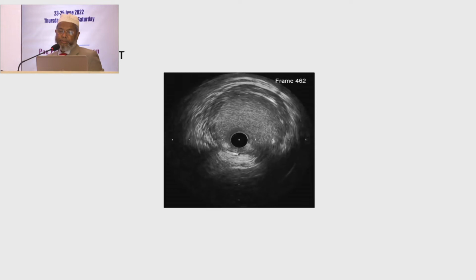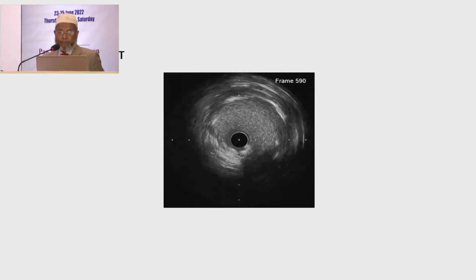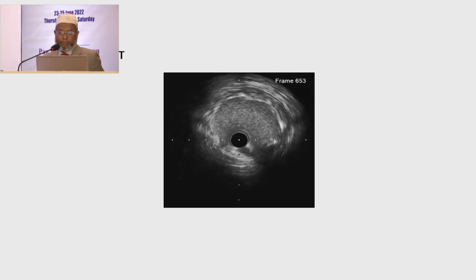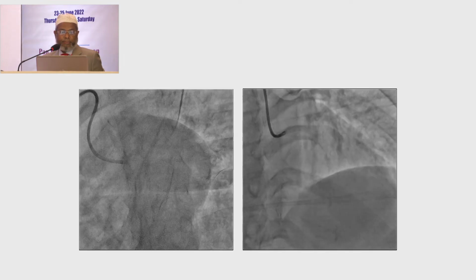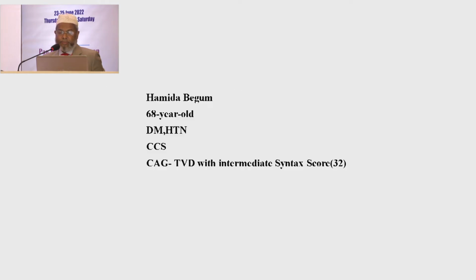This stent has come and it's well inflated. There is no underexpansion, and this is the final result after angioplasty.